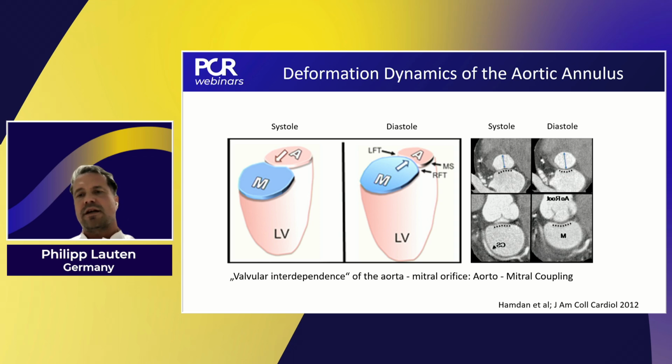We do not often use the diastole sizing, but if there is an intermediate sizing between two valve sizes, then it's really important to see both cycle parts for sizing and for the decision which valve, maybe another valve than in the first thinking, but maybe also a bigger valve if you use supraannular valving.